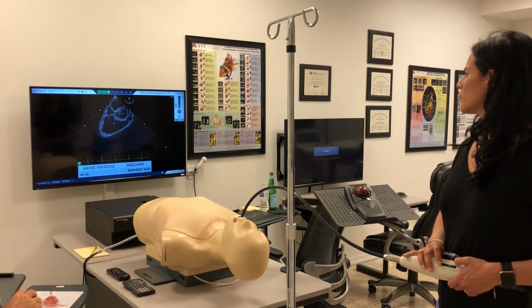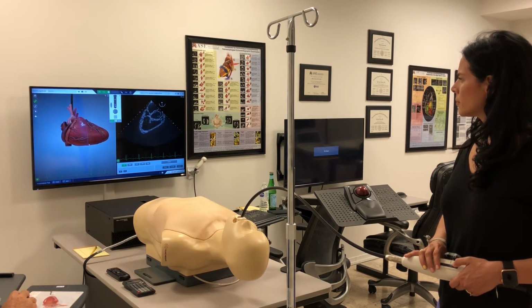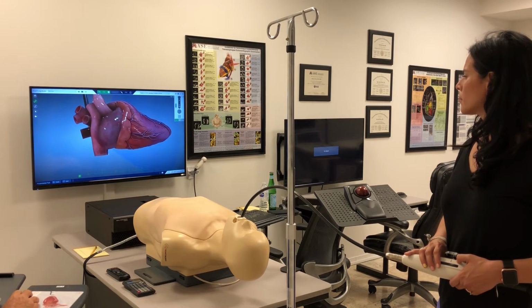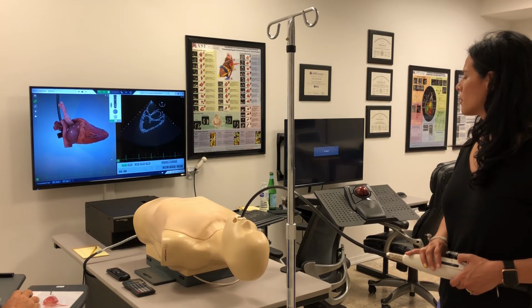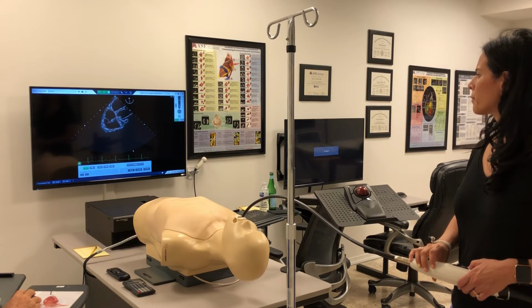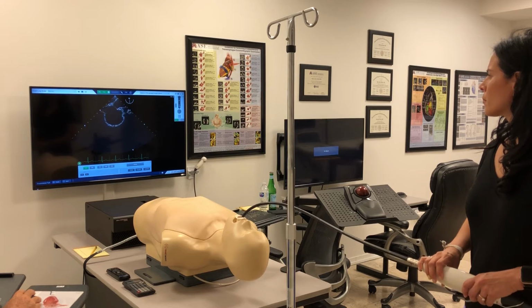Very nice. And hold that right there. And let me just show you where you're at now. You're in a perfect sagittal plane, but the vena cavas are way over here. And so you have to recognize that to get over to the cavas, let me just zoom in on it, to get way over here to the cavas, you'll need a hard right turn until you develop both the superior and inferior vena cava. So now you're turning right a little bit more, and you keep going.